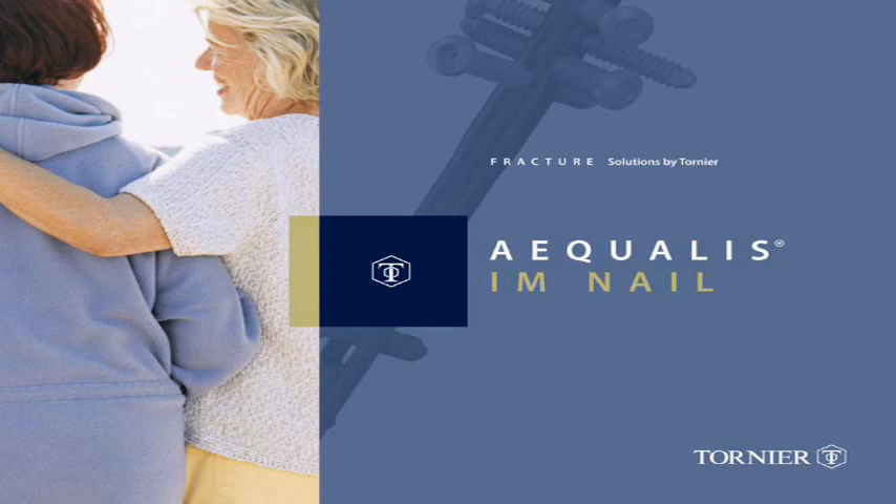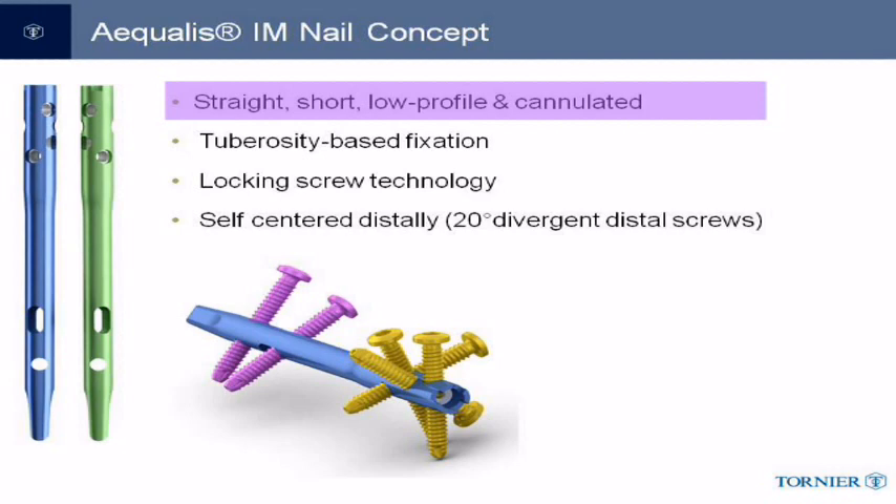The Aqualis proximal humeral nail and instrumentation have been designed for angular stable minimally invasive reduction and internal fixation of proximal humerus fractures. Unique features of the nail include that it is straight, of small diameter, and that it is cannulated.